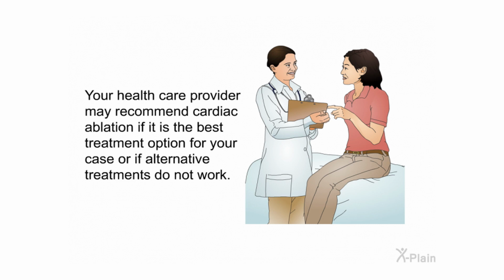Your healthcare provider may recommend cardiac ablation if it is the best treatment option for your case or if alternative treatments do not work.